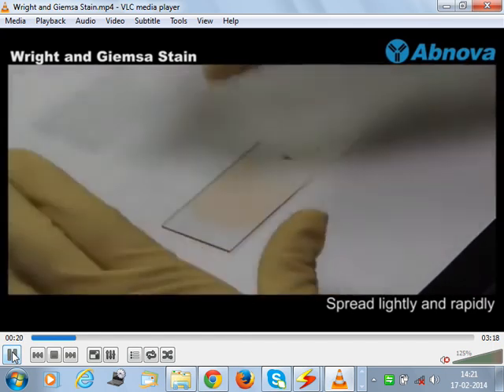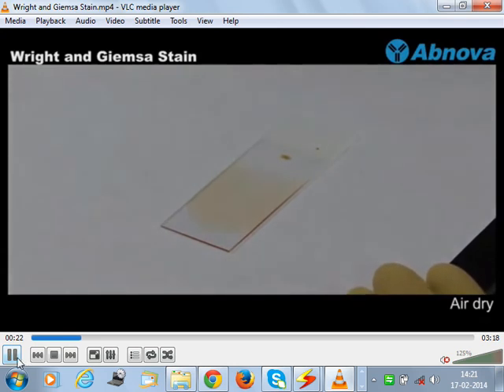So once again, to see the smear, notice the color. I am very impressed about the color of the smear. It shows it is pretty thin. And look at this area, how long it has come. Can you see that? And another point is, when you make a smear, always this area will be thicker, and as you progress away, there is the head, body and tail of the smear. Easy, no? Head, body and tail. So which region will be thinnest?